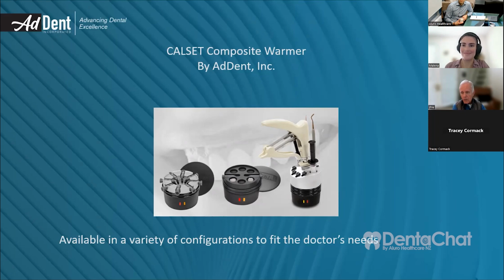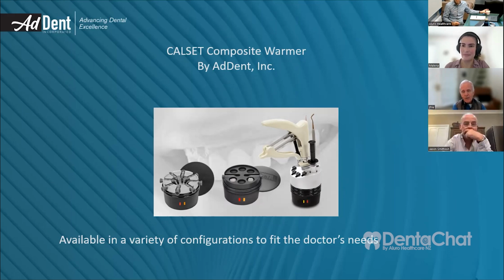There's no standardization. So you have compules that are different sizes. You have syringes that are definitely different sizes. And so if you have, I would call it a very fat syringe, it might not fit the multi-pro, and you'd have to use the 7-hole syringe tray if you want to use that particular syringe.